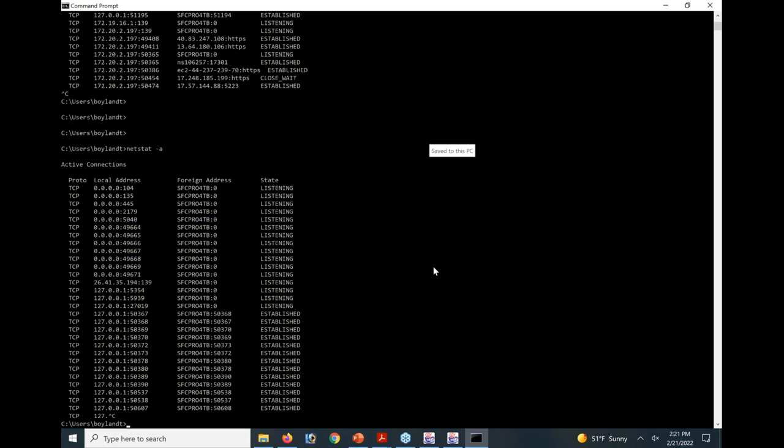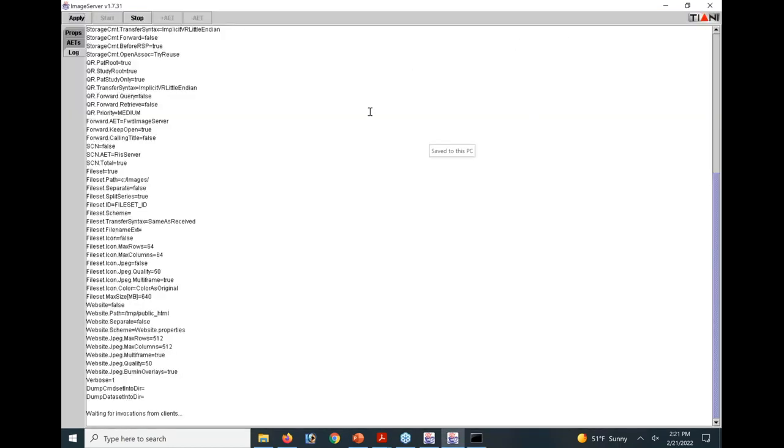So what caused that port number to be opened on my computer? That software. The software running opens up that port number, and now it's ready to receive. So effectively, my laptop right now is a PACS. It has an IP address, has an AE title, has a port number, you can send an image to it.